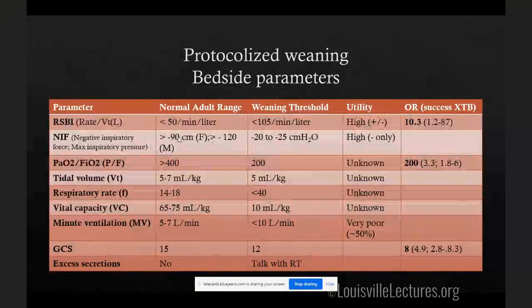Exactly. And so the PF ratio is important for ARDS, but this is something you can just keep in mind, like as Sam was saying: how much support am I delivering? And a low PF ratio in the setting of ARDS actually heralds different levels of mortality depending on how severe they are. But I just wanted to provide you guys this information so that ICU and ventilators were less scary.